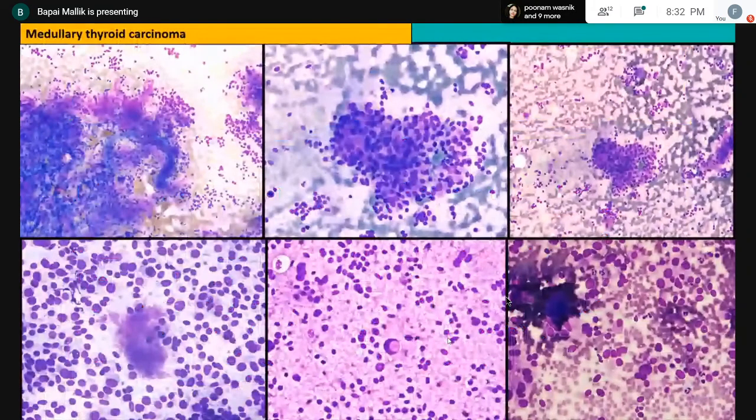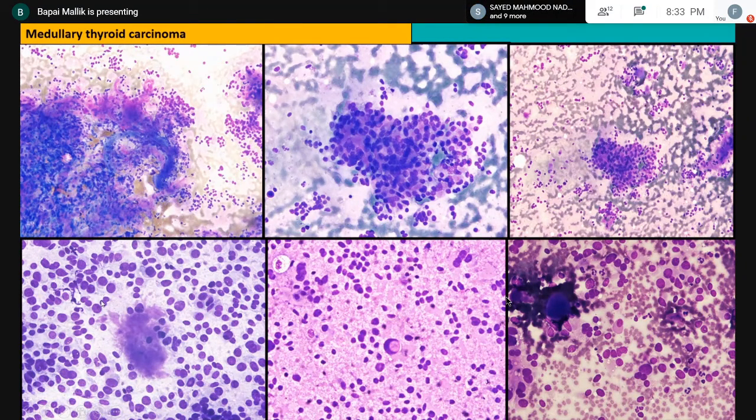Right, this is a collage of medullary thyroid carcinomas. As you can see over here, it's a big fragment, cells just falling apart at this particular magnification. Very difficult. Here again, it shows kind of a microfollicular pattern, right? But again, cells coming out over here. Again, a very low magnification with cells falling apart. But look at this one. This is pretty helpful. A very isolated population of cells, separate, dispersed. This material is most likely amyloid, right? And the cells show anisonucleosis, an isolated population of cells showing anisonucleosis, very commonly found, I'd rather say, in medullary thyroid carcinoma. Once again, you see a very similar pattern.